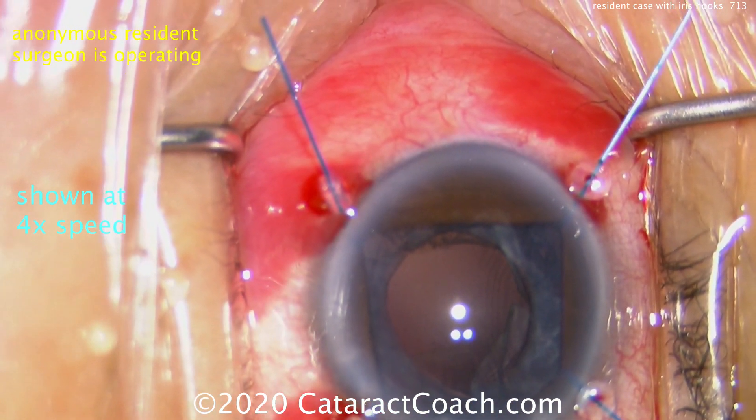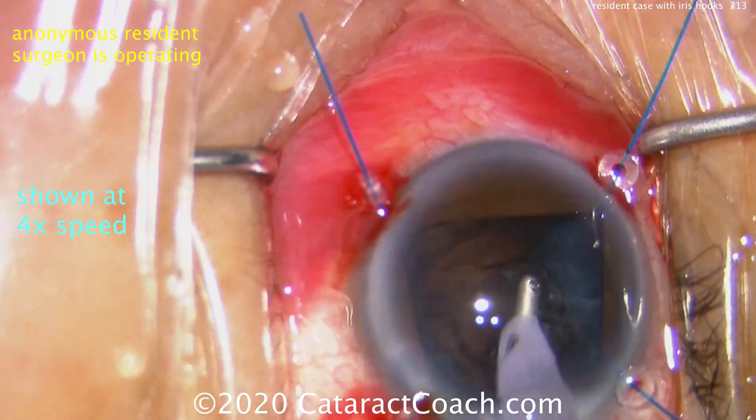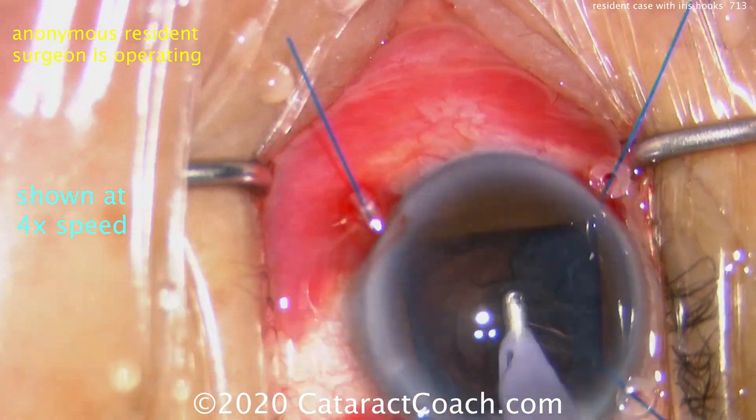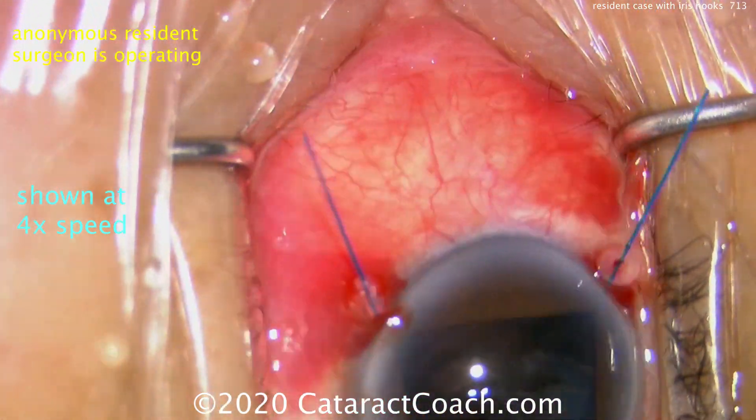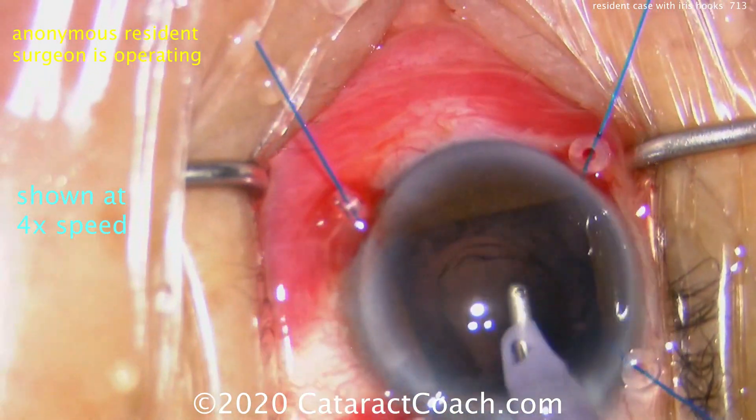Nucleus is out — that looks great. Filling up the capsular bag with a little viscoelastic to keep the anterior chamber formed. Now going in with the IA probe to remove lens cortex from all around. That looks really good — nice technique here with the iris hooks.